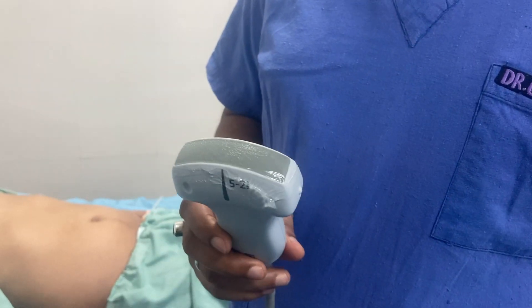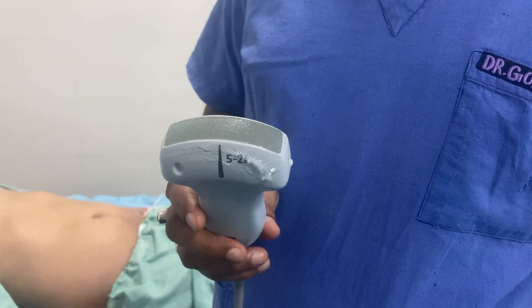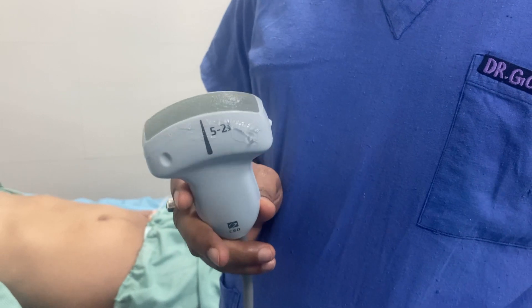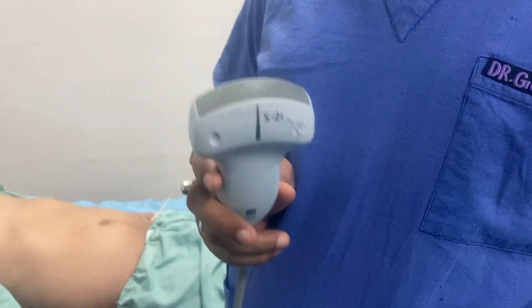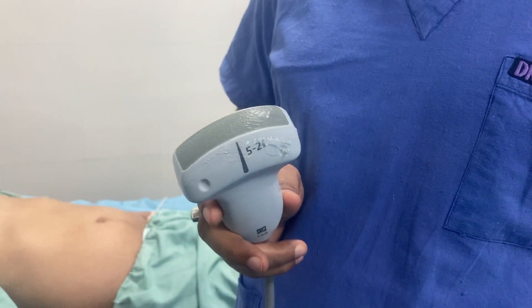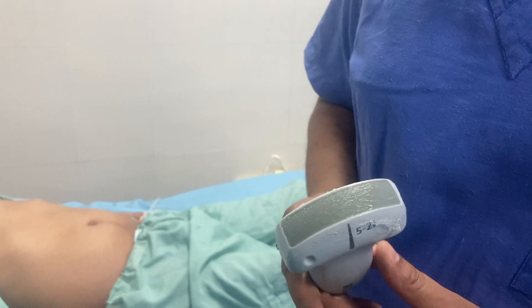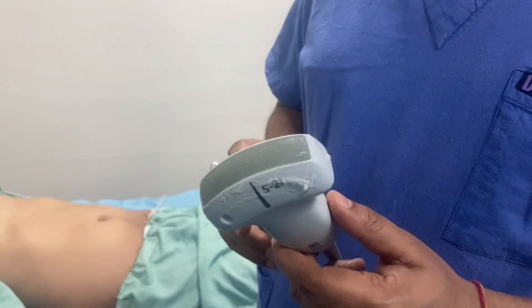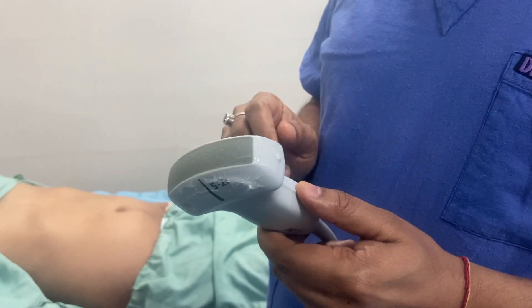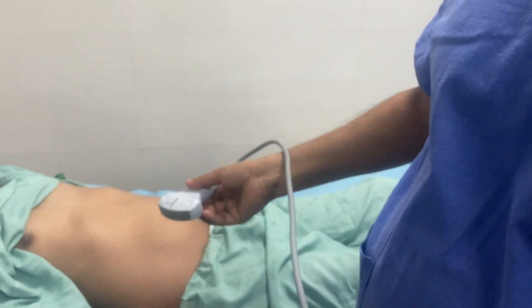For the gastric ultrasound, we use the low-frequency curvilinear probe. First I will assess the patient in supine position, and we will place this probe just below the xiphoid process in the epigastric region.